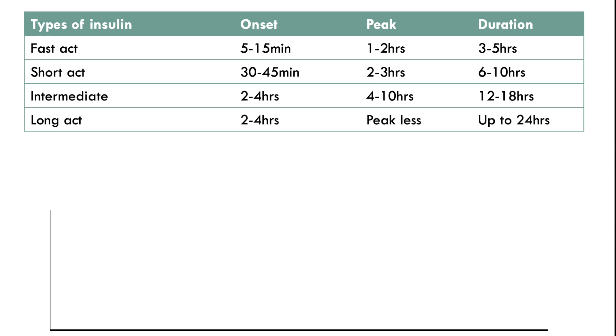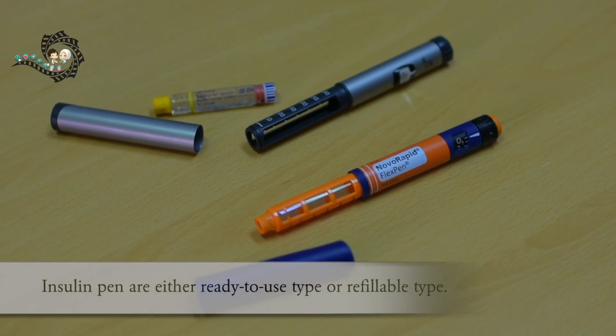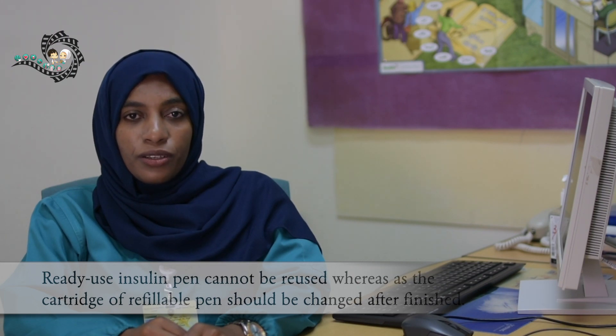Classifications of insulin are as follows: rapid acting, short acting, intermediate acting, and long acting insulin. Insulin pens are either ready-to-use type or refillable type. Ready-to-use insulin pen cannot be reused, whereas the cartridge of a refillable insulin pen should be changed after it is finished.